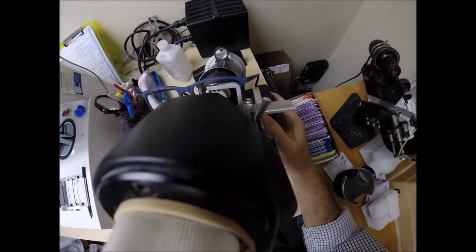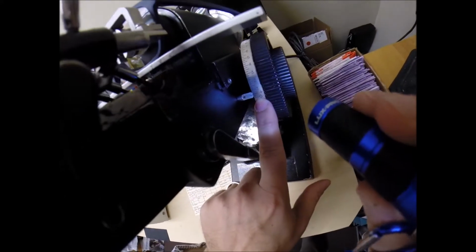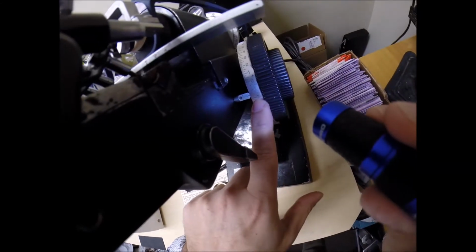We're going to read the power, and we're getting plus 50 again, exactly halfway between 0 and 1. We're going to minus 2 diopters from that, and we end up at -150, exactly halfway between 1 and 2. So that is cut perfectly. I couldn't have done any better if I'd cut these lenses myself.